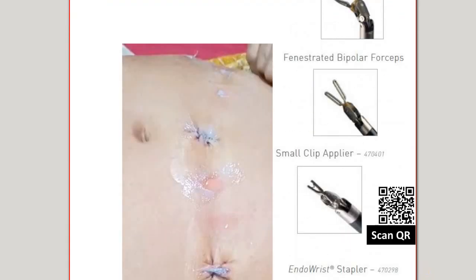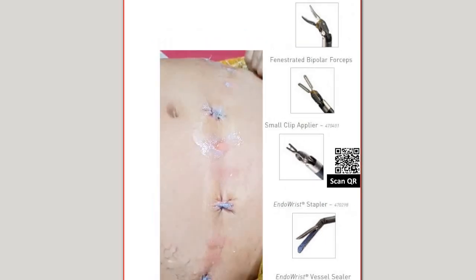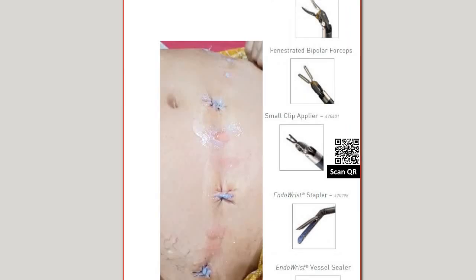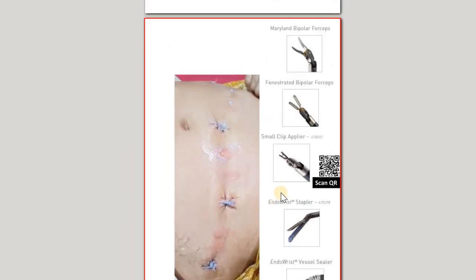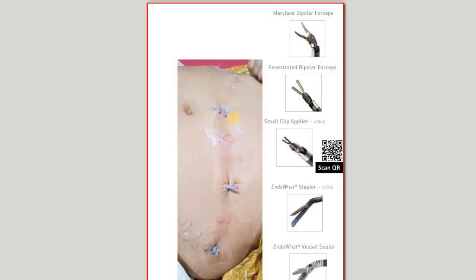And look over here, what you see is the picture of one of the patients, a 65-year-old patient, and she had a uterus operation where the uterus was removed. And as you can see over here, just let me show it to you, instead of giving a big cut like this in open surgery, we have 4 small cuts, one over here, another, and this one.